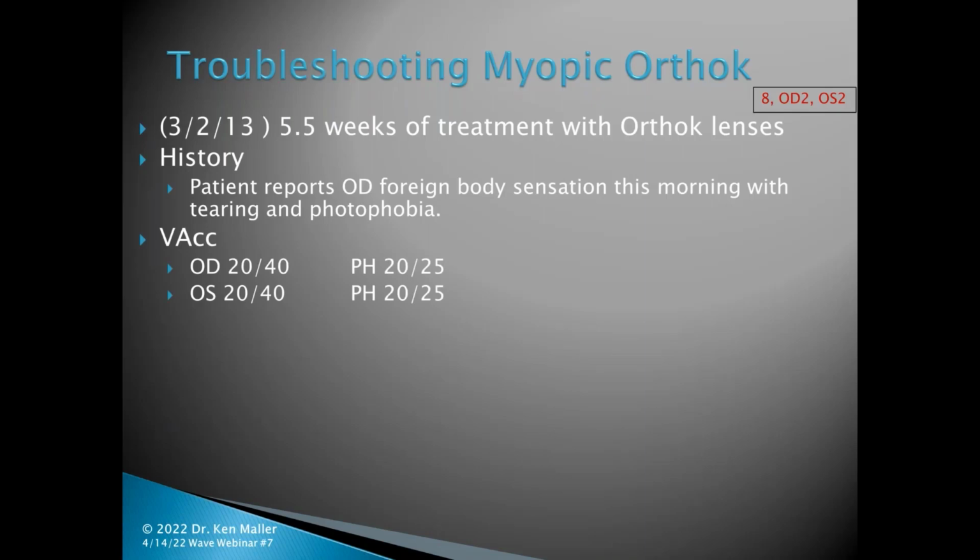This says his vision was corrected, but I'm not really sure with what. I don't know if that was with the contact lenses that they just put on and took an acuity with those contact lenses on, or if it was a pair of glasses. I have no idea what they actually used. It just said it was corrected acuity, but it was best at 20/40, only pinholing to 20/25 in each eye.